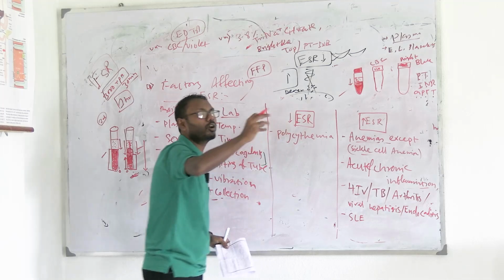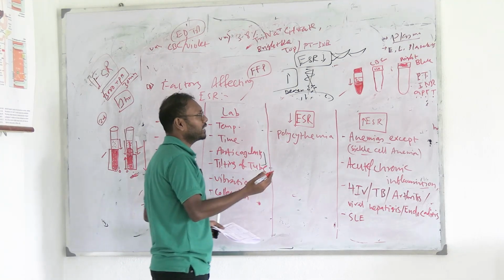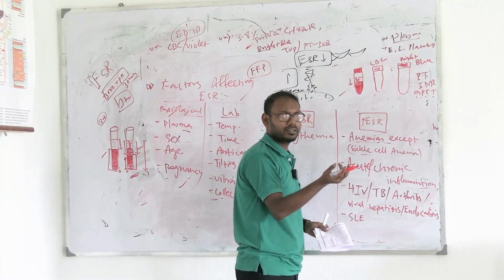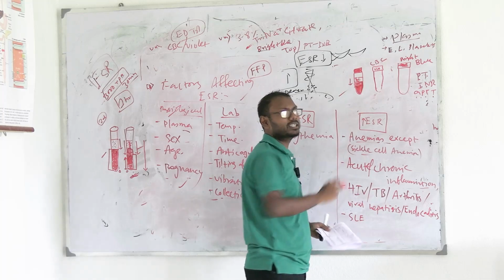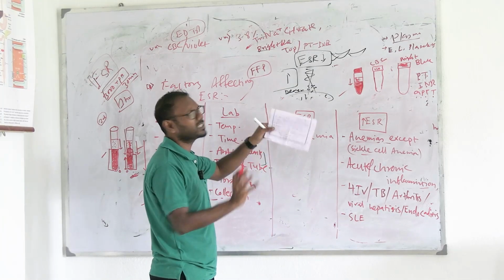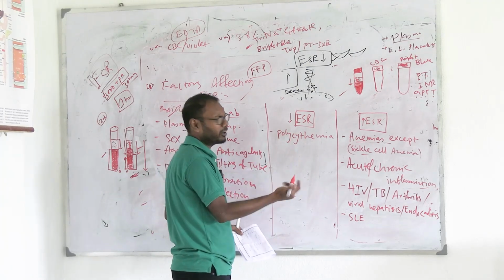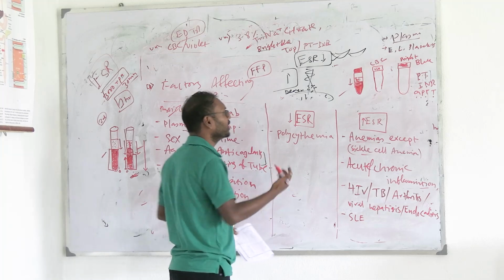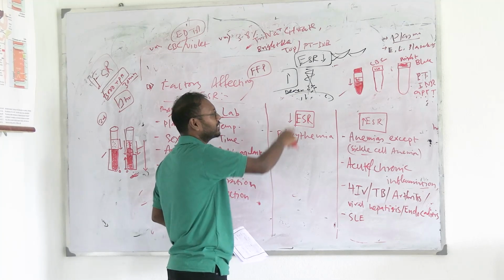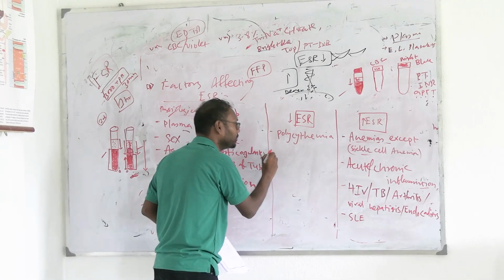But যত বেশি আমার ভলিউম থাকবে, আমার সেডিমেন্ট করতে তত বেশি সময় লাগবে। সিম্পল। সেই জন্য even if the amount of sedimentation is higher, উপরে প্লাজমাও আমার কম থাকবে। কেন? There are much more erythrocytes in our blood. So the sedimentation will take a longer period of time because there are so many erythrocytes to sediment. That's why polycythemia vera অনেকে বলে, তোমরা ফার্স্ট ইয়ারে জাস্ট polycythemia বললেই হবে। So polycythemia will have a lower erythrocyte sedimentation rate. Sedimentation amount may be higher, but the rate is lower because it takes more time to precipitate.